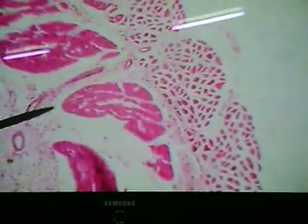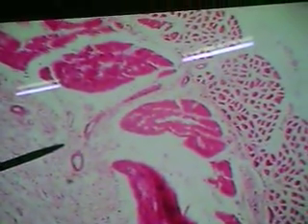Submucosa. This is a little artery. As you can see, this is very interesting. A little artery just tunneling through the muscularis externa. The esophagus, as you know, has three major sources of arterial blood supply for the upper third, middle third, and lower third. This is an artery literally just tunneling right through the muscularis externa. So there he is, going right through the muscle fibers. And see him right here now in the submucosa. It's a small little arteriole.